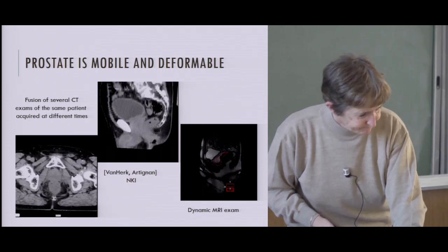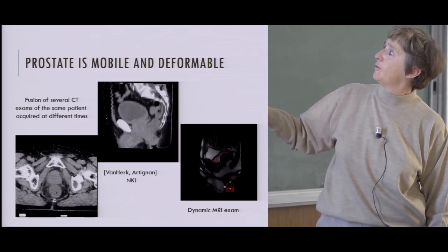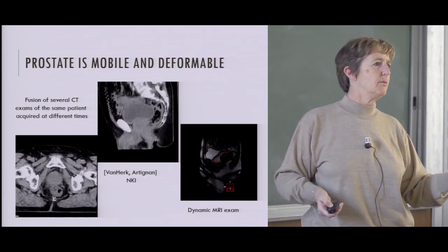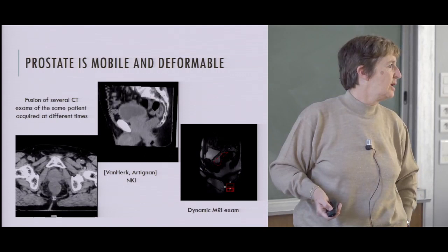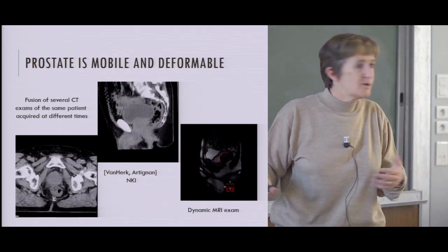About the movie of the X-ray scanning, you have a period between the slices. Here it's for a patient that had some radiotherapy treatment, so I think they made a CT each day or something like that. So this is not a real-time movie. Here it's real time. The MRI is real time, so during a certain, I don't know, 20 seconds, you see how it moves.